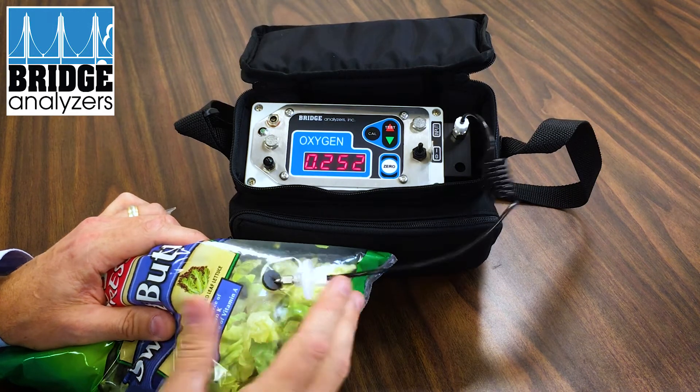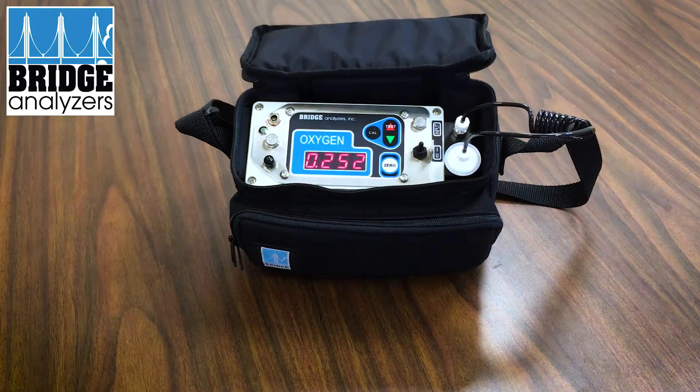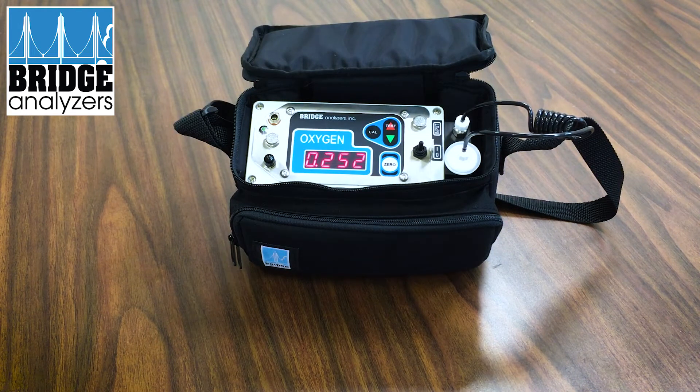There's our second test complete. At this point I can remove the needle and put it back in the manifold, and I can record that oxygen level — in this case it's 0.25%. We've run a test, and we can then take our analyzer and go do additional tests. That's how the analyzer essentially operates on a standard basis for testing packaging that has been purged with gas other than air.